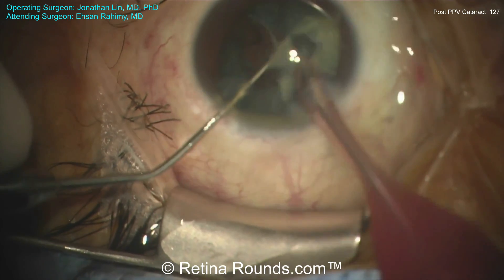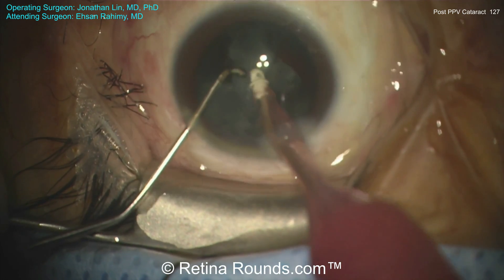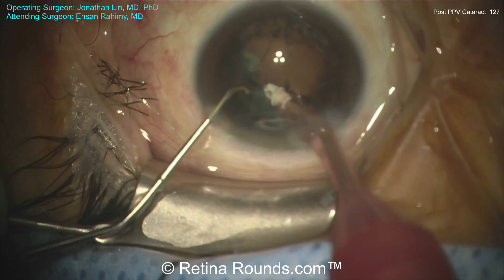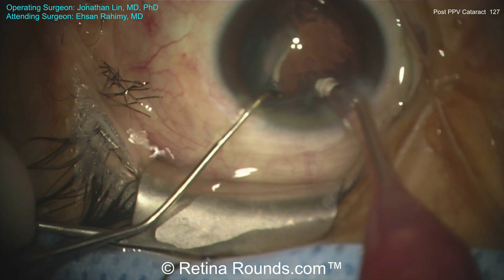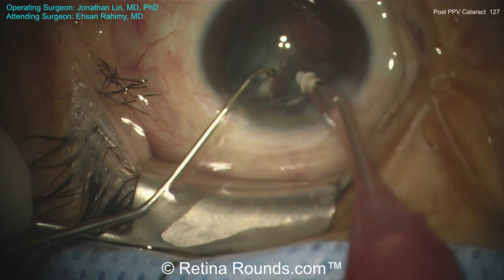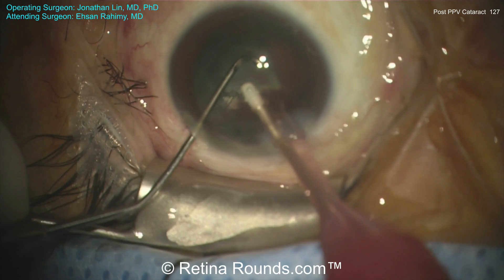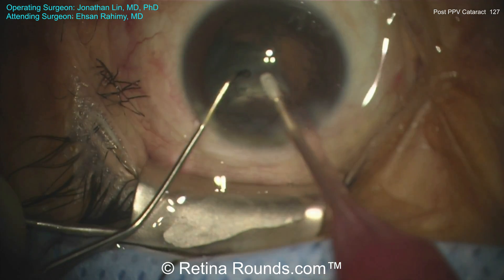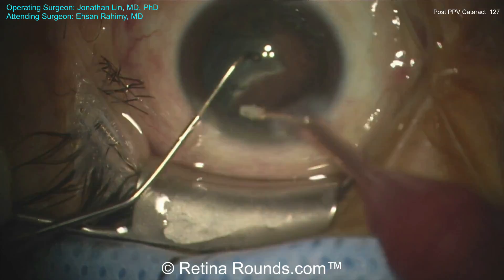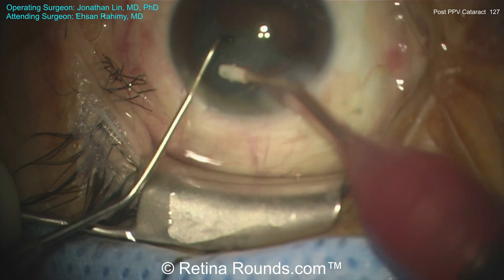It's also a good idea to bring lens material up into the anterior chamber, which is what Dr. Lin has done, performing the bulk of the phacoemulsification in the anterior chamber away from the posterior capsular violation. The IA probe is being used to remove some cortical fragments, and you can see some lens material floating in the posterior segment. Dr. Lin is being very careful not to fish for that lens material from the anterior approach — it's much safer to do that through a pars plana approach. Once cortical material has been removed with the IA probe, a lens will be placed, likely a three-piece lens in the sulcus.